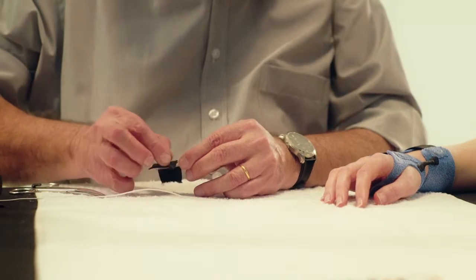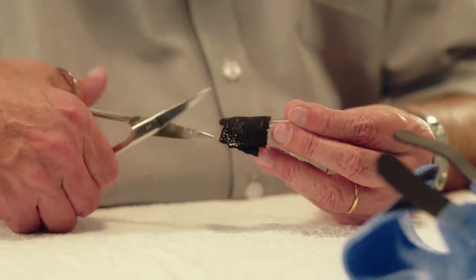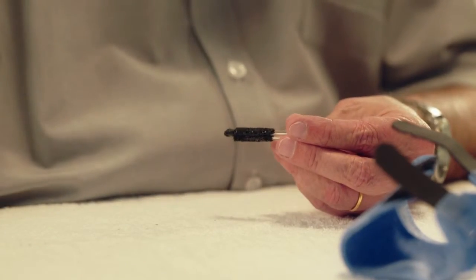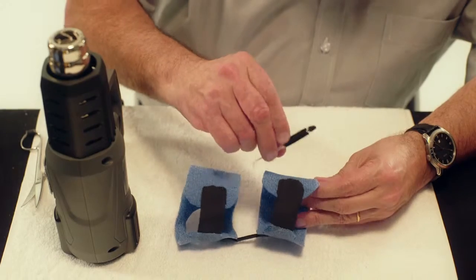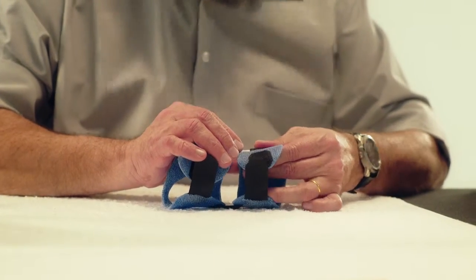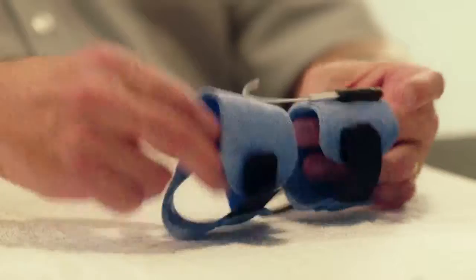Heat a small strip of Orficast and roll the Orfitube with the Orficast. Cut away any of the excess material. Heat the Orficast on the Orfitube with a heat gun and heat both portions of the orthosis on the ulnar surface. Stick the Orfitube onto the proximal ulnar side of the orthosis.